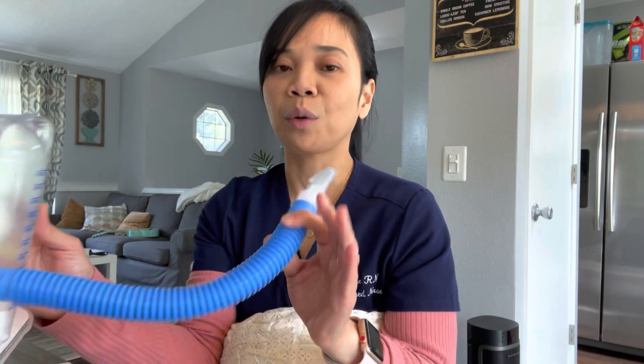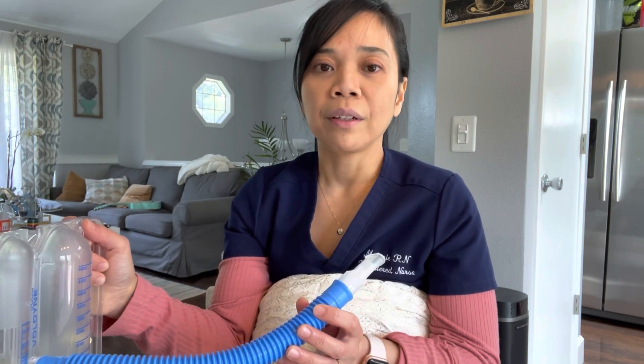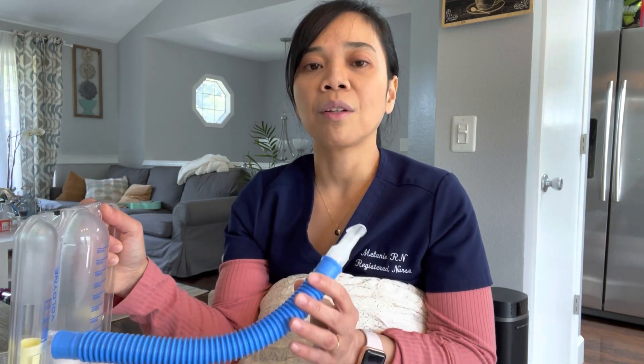Tell them not to breathe too fast or too slow, because those are not effective. They can do this lung exercise 10 times every hour while they are awake. Sometimes your patient will complain that they feel lightheadedness, nausea, or dizziness — it's okay to rest, and always encourage them to do the exercise again as soon as they feel better.